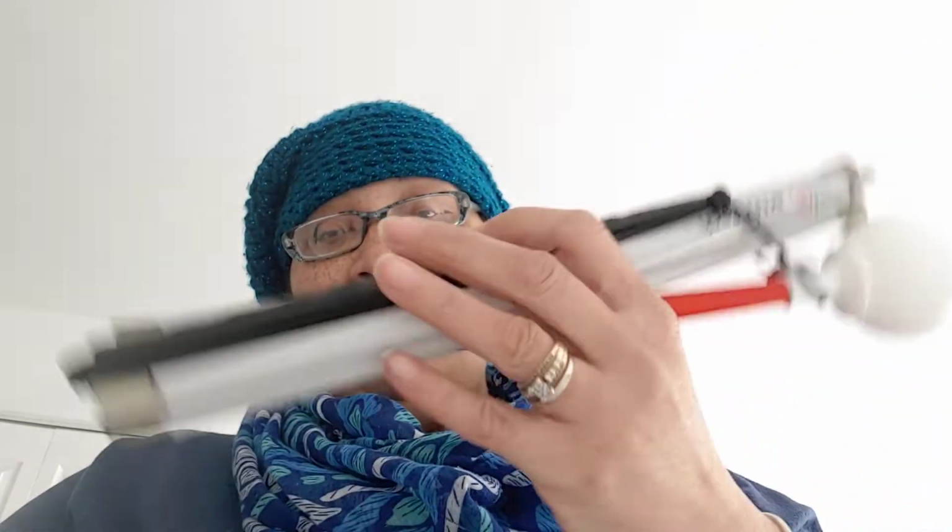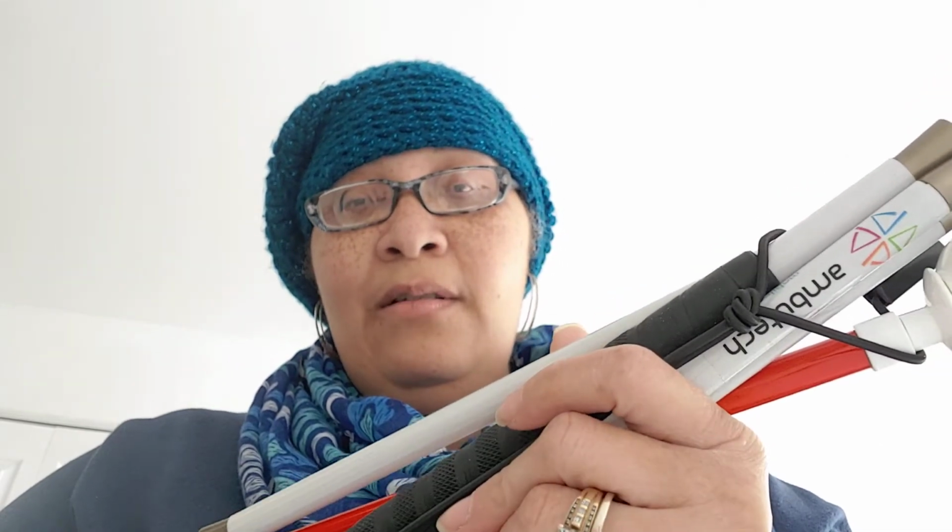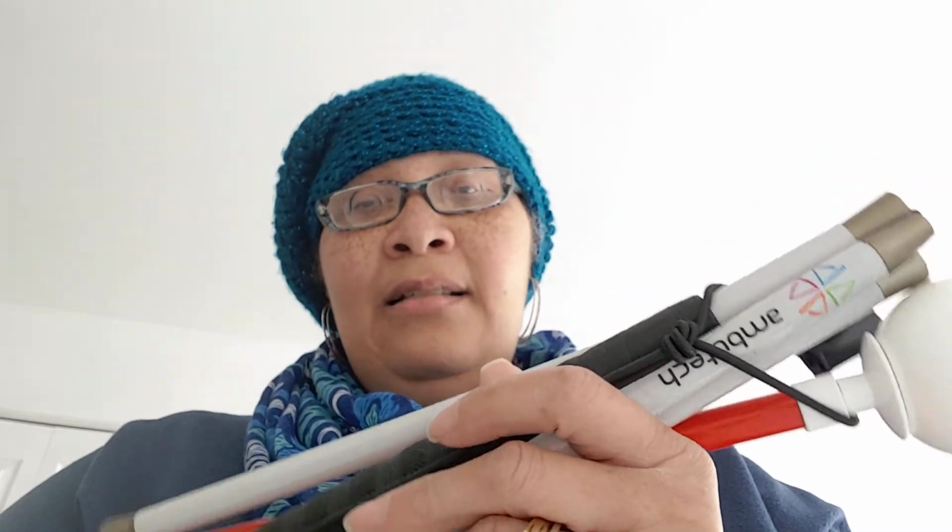Right now it's all folded up. And I just don't like people looking at me and pointing. It's one thing because I stand out because I'm really tall, but it's another thing to use this and other devices. I use a cane. And most of the time, if I use my rollator, it's because I'm indoors, or if I have to go somewhere where it requires a lot of walking, I'll take it with me because I know that my back and my legs are going to start bothering me, and then I can just have a seat and sit down.